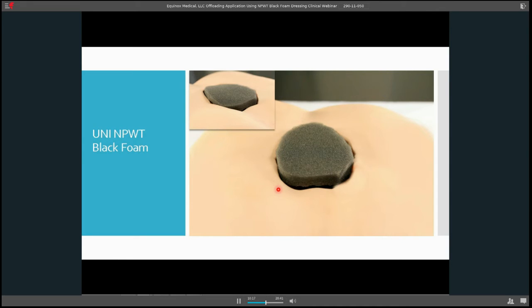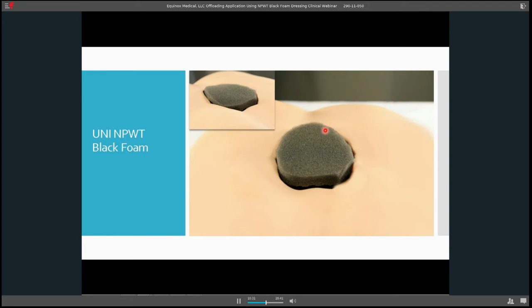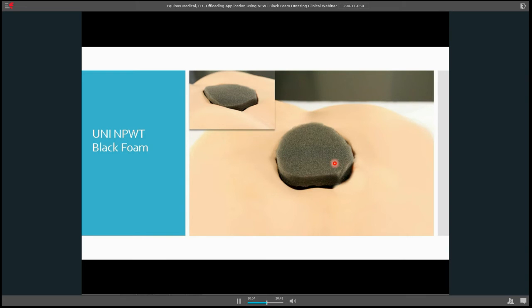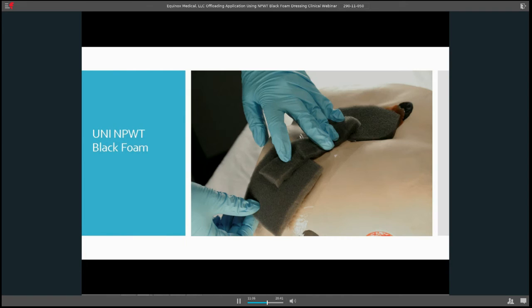Here we're using black foam, but there is the potential that there may be an area of undermining or tunnel where you would be using the white foam, which is actually hydrophilic. It likes moisture. So it's a great thing to be able to put down in a tunnel or in undermined areas. Once assessed, it can't be used in everything. That would be a nursing assessment. Here, if you notice, I've cut the black foam and the black foam is a little bit higher. This is my main wound. I want to fill the cavity without overlapping onto the intact skin. You don't want the black foam touching. But here I've skin prepped, I may have put some drape to further protect. We're placing it gently in without forcing the foam into the cavity. That's very important because we do not want to cause any damage to any of the tissue.